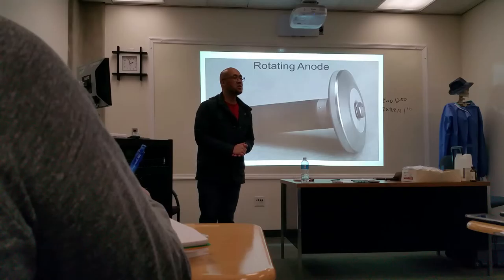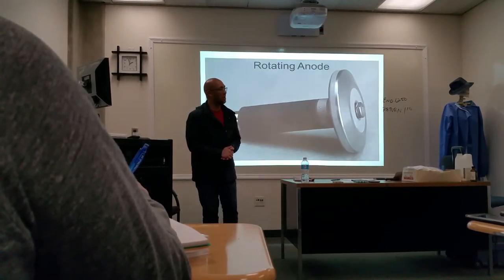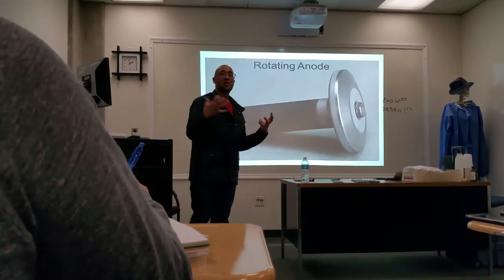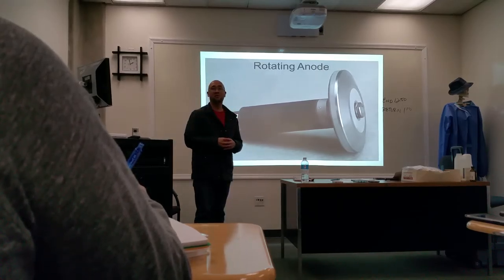All right, any questions? So does pitting not really occur with this? It still can. And once you get pitting in the tube, you essentially have to replace the entire X-ray tube. The glass tube itself can cost anywhere between $30,000 to $75,000 for an X-ray tube.